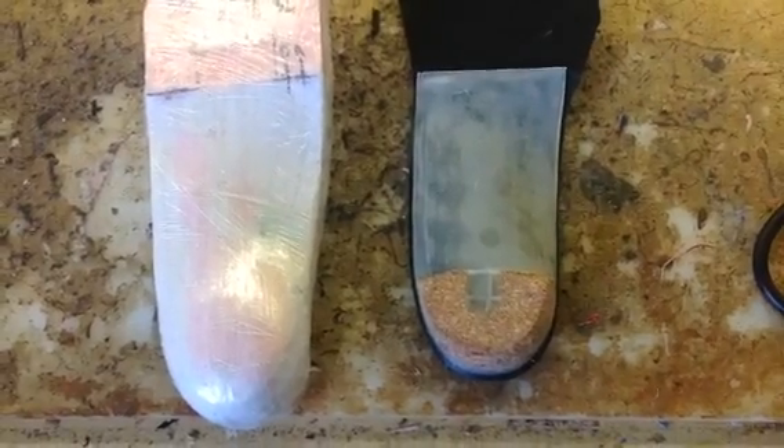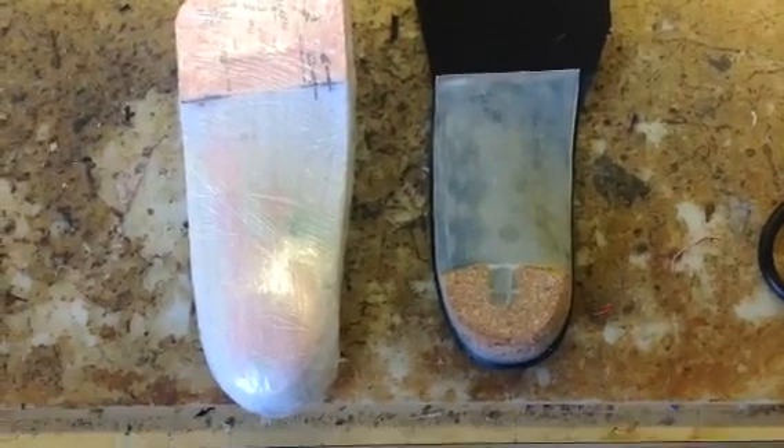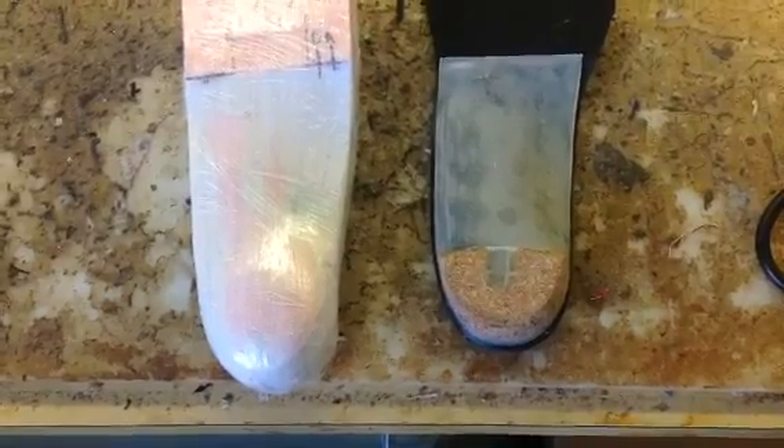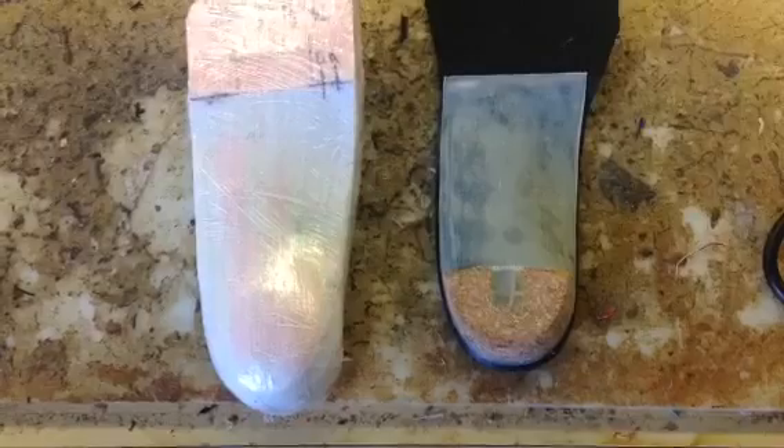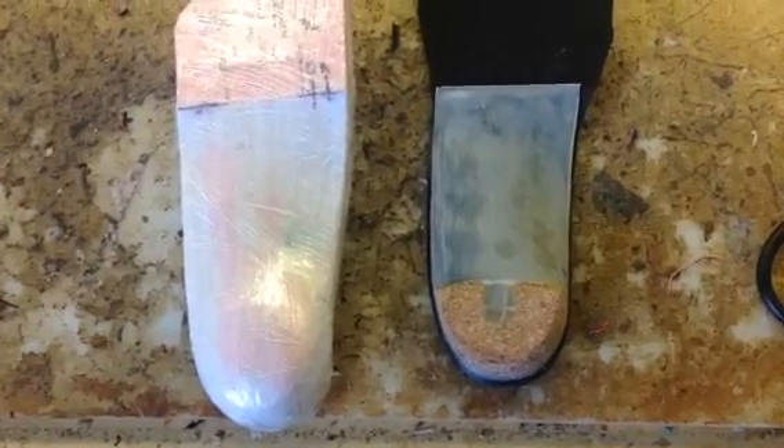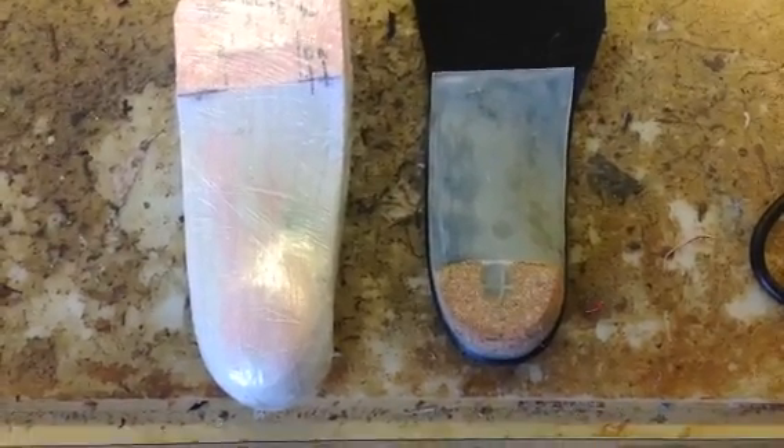Hello, and welcome to another post from Dr. Blake's Healing Soul. Today we're talking about orthotic devices and manufacturing them for various patient-specific needs.